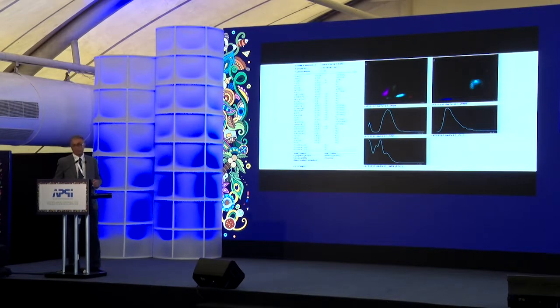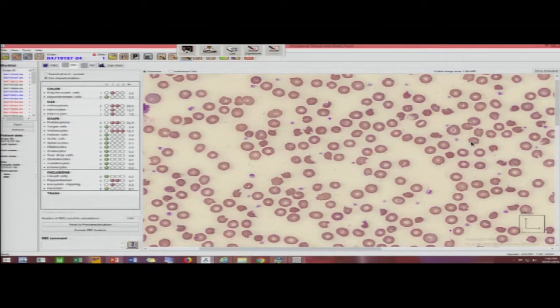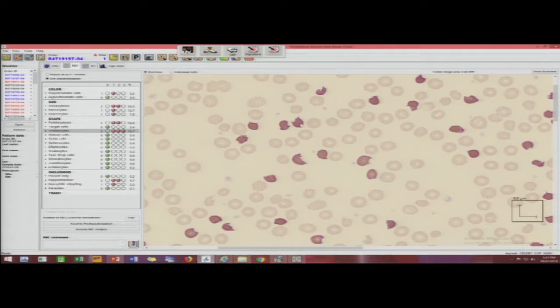A 70-year-old lady with a drug history of Dapsone, anemia for evaluation, hemoglobin of 7.9. What showed up was schistocytes at 13.7 percent, and the moment you click on schistocytes, all the schistocytes show up — not necessarily all, as some may still be missed — and you get a percentage. Now this becomes relevant in emergency as well; this is a critical result to be reported. You get a value that you can use — it may be absolute or just an approximate number.